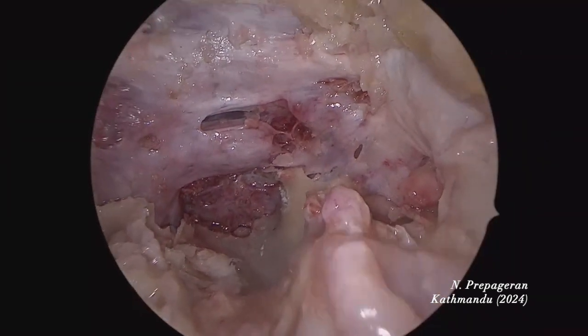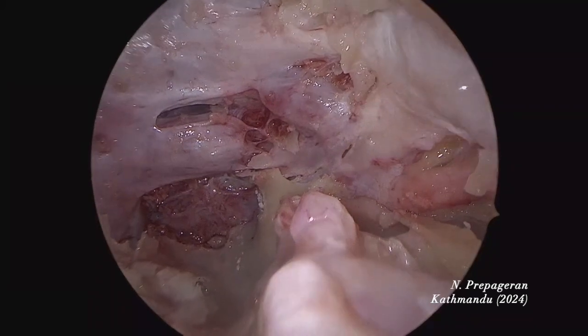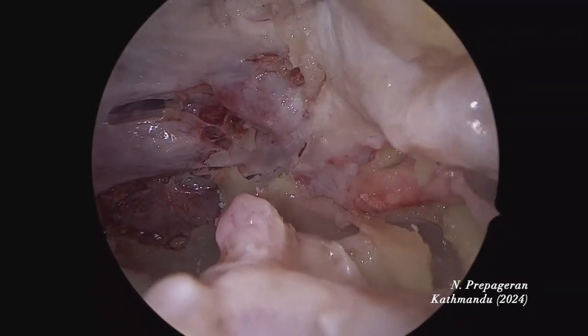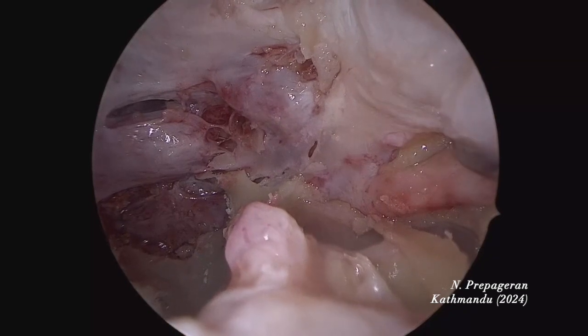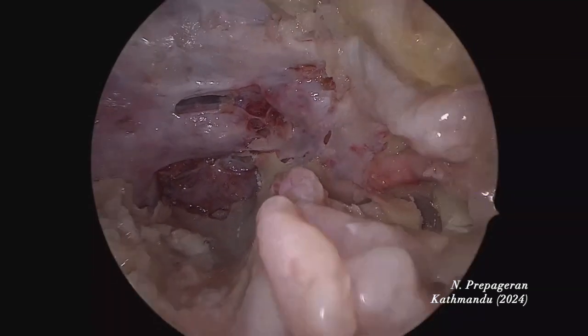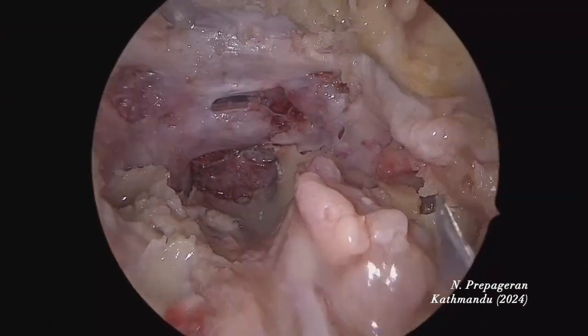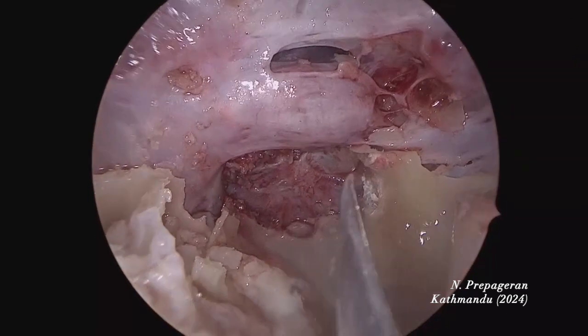If you look here it will be much easier. V2 is exposed very nicely. Foramen rotundum there. This is the maxillary strut and here would be V1. Orbital fissure. V3 would be down here. Now we do pituitary surgery first. If you have a tumour in the pituitary gland, you first open the dura.